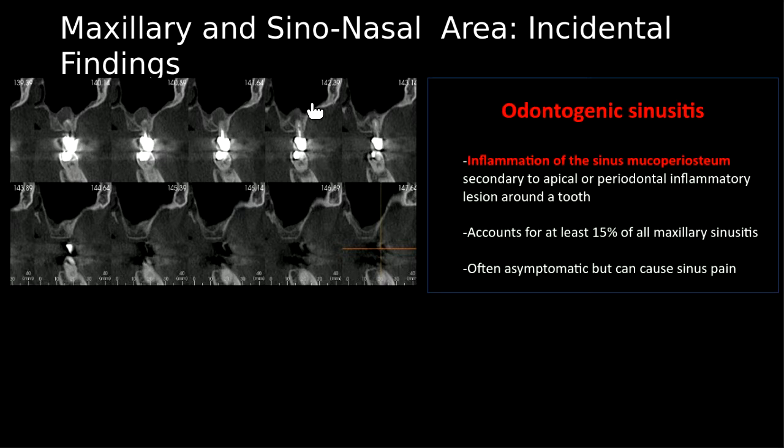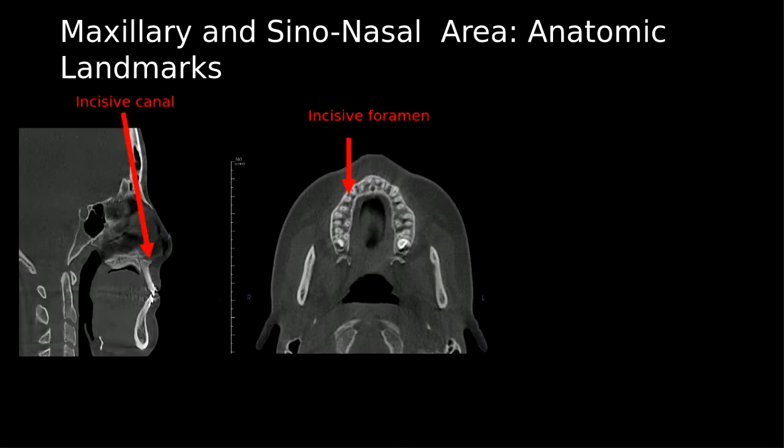And the first way you can see is through CBCT, and you can really plan your surgery, treatment, diagnosis, everything. It really helps you. It is not just a tool now; it is more than a tool. You can use it, apply it, and make your life easy and do more cases.